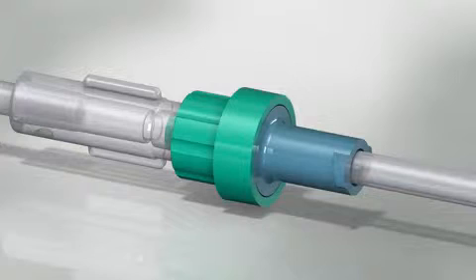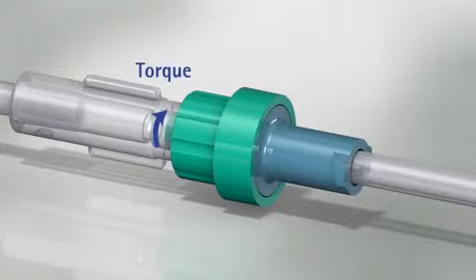The process of attaching a component to a valve can impart stresses too. For example, the torque used to attach a valve to another rigid component on the device could cause a problem, so it's important to understand the mechanical limits and stress loads of your components.